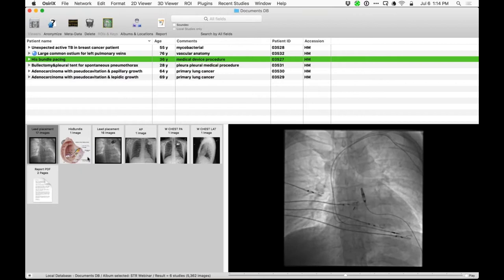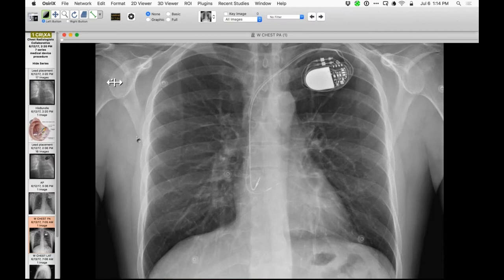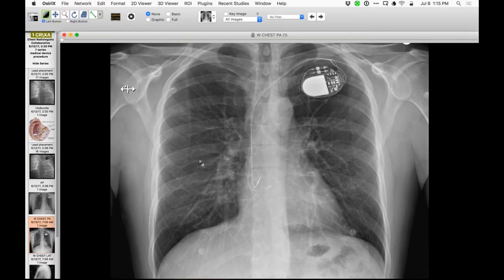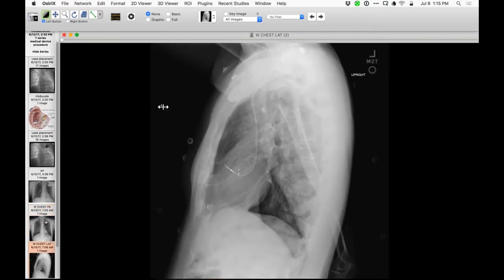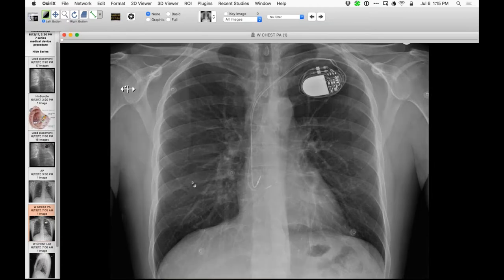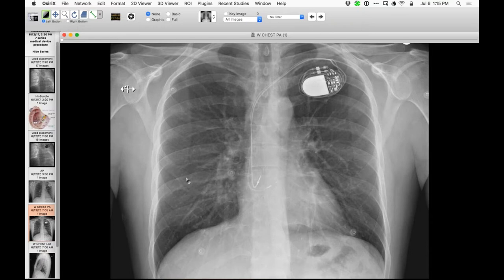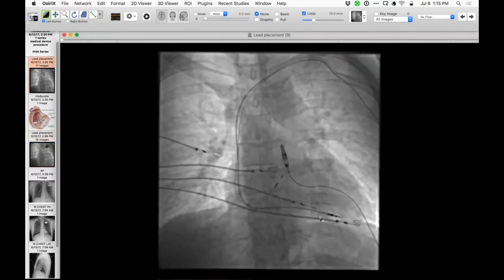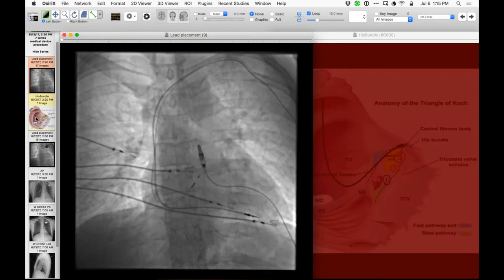This case involves the pacemaker - I think it's the first case I've noticed like this. It looks like a left pectoral pacemaker. You report: one lead terminates in the right atrial appendage and the other terminates... and then you look and say where is this other one? On the lateral, here is the usual atrial appendage lead and here is the other one that doesn't look right. This turns out to be a pacemaker lead placed intentionally for so-called His bundle pacing.